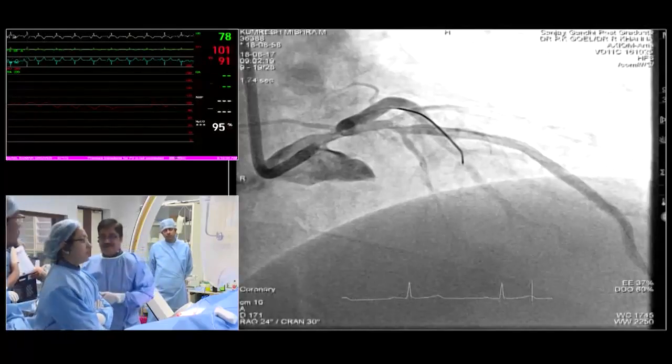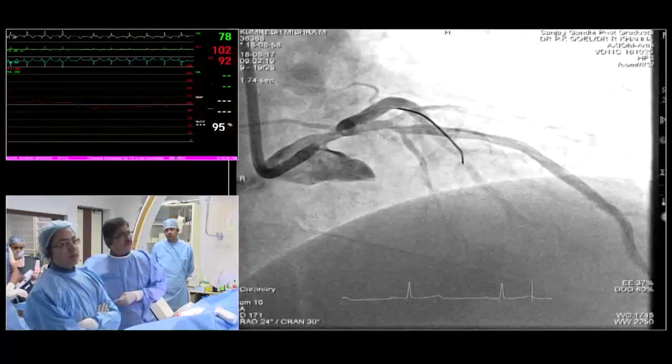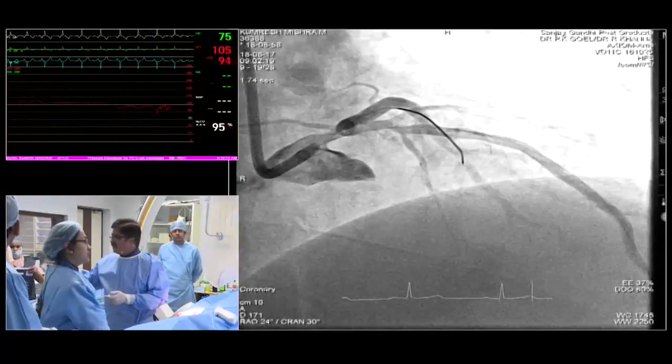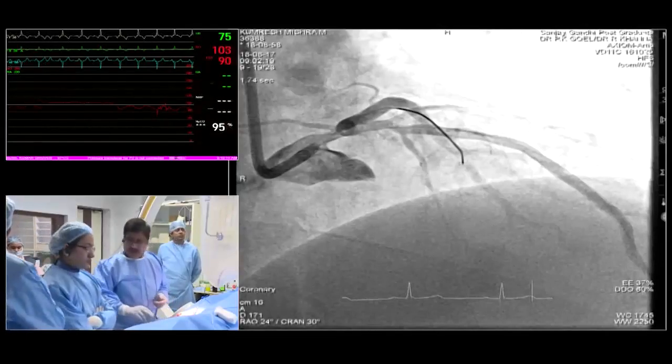When I say 18, I had guys. Let us do 20 millimeters. Let us do ostio-left main to the LAD. Let us do 20 millimeters. Okay. 3.5 by 20, come on. I think, come on, let's get it.